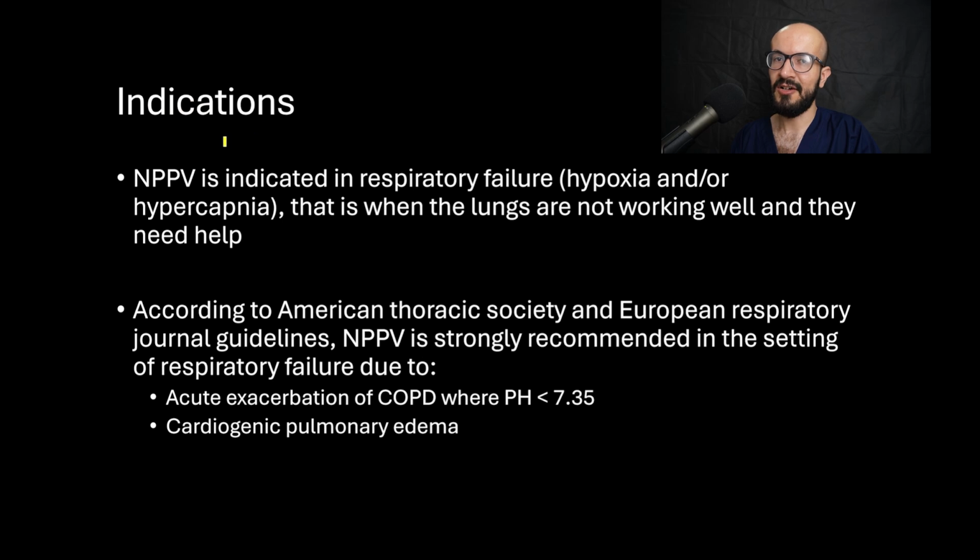Now let's talk about the indications. Positive pressure ventilation is indicated in respiratory failure, which is hypoxia and/or hypercapnia, and that is when the lungs are not working well and they need help.